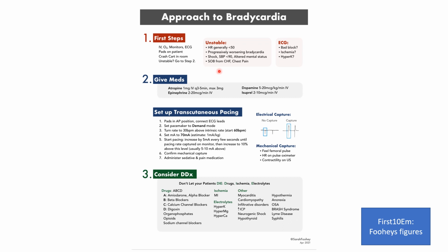And it's good to mention that the patient is unstable, meaning if they have ischemic heart disease, syncope, shock, or heart failure, those are the four what we in Danish call the 4 S's. Then you have to just treat them, and we'll see the treatment algorithm soon. But you also have to think of the causes, right?